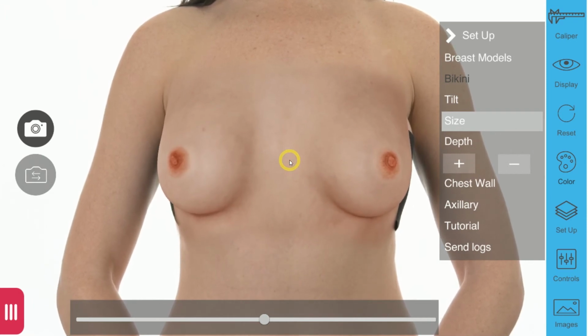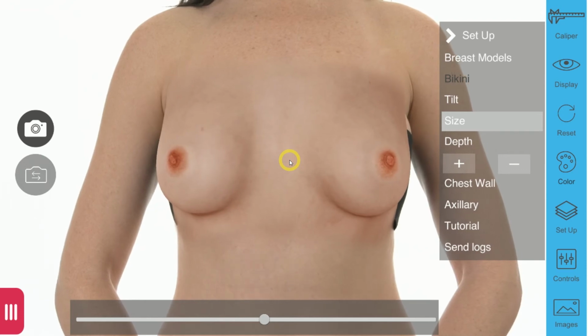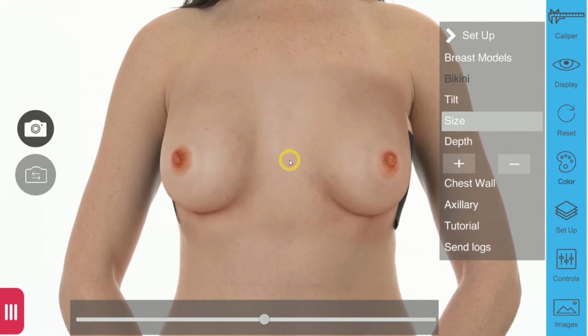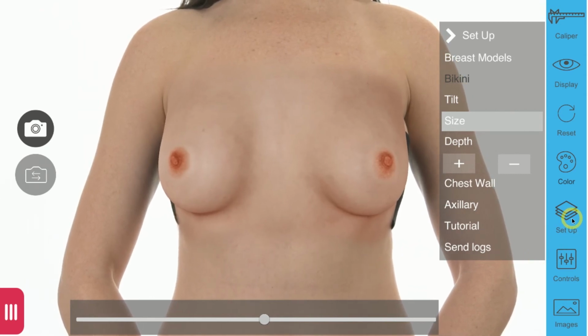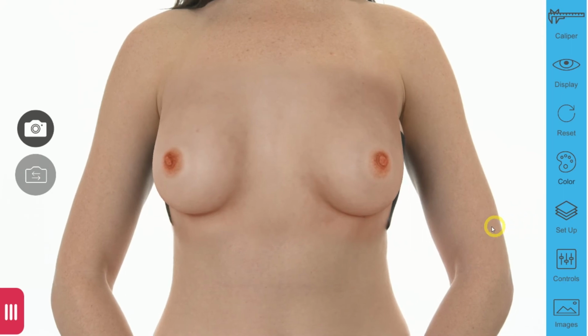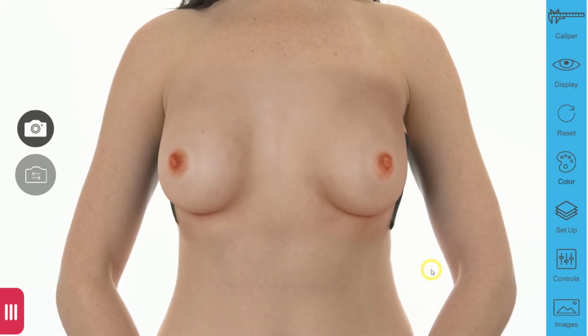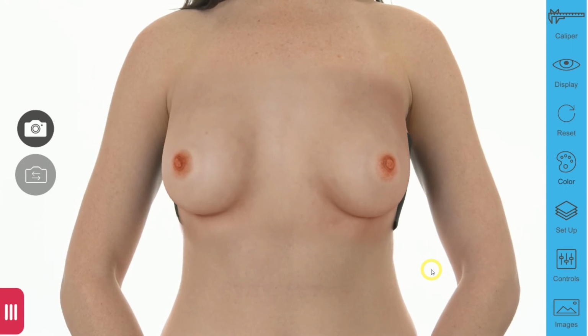Remember, if the setup isn't performed correctly, the results will be impacted. Your patient experience will be dramatically compromised as well. It may take a little time before you're an expert with this, but once you've seen how happy your patients are, the more committed you'll be to the process. Okay, you're already done and ready to continue your consult.